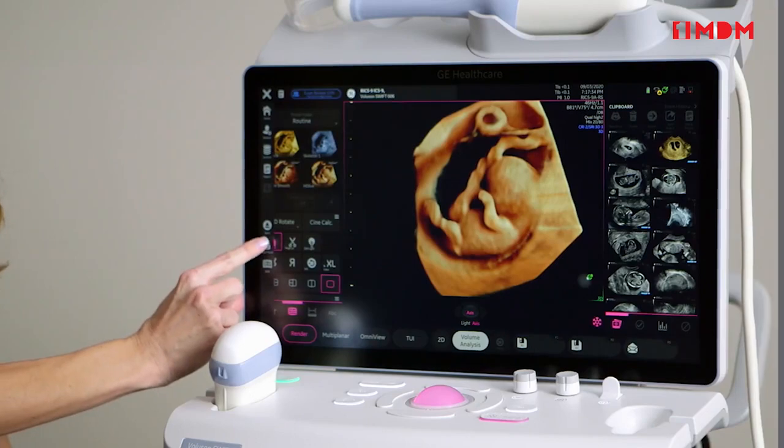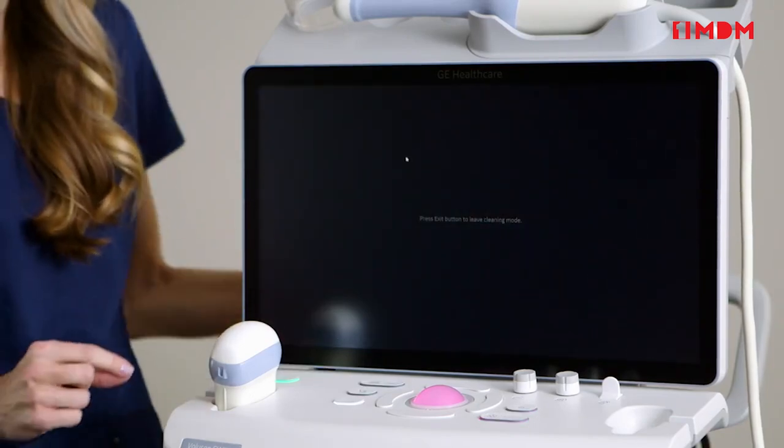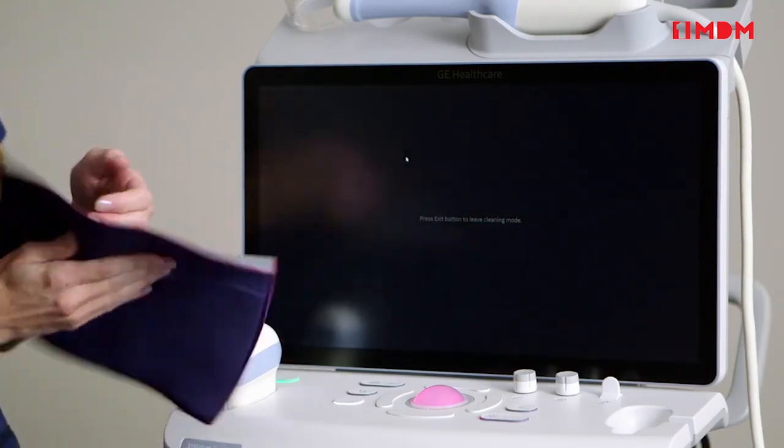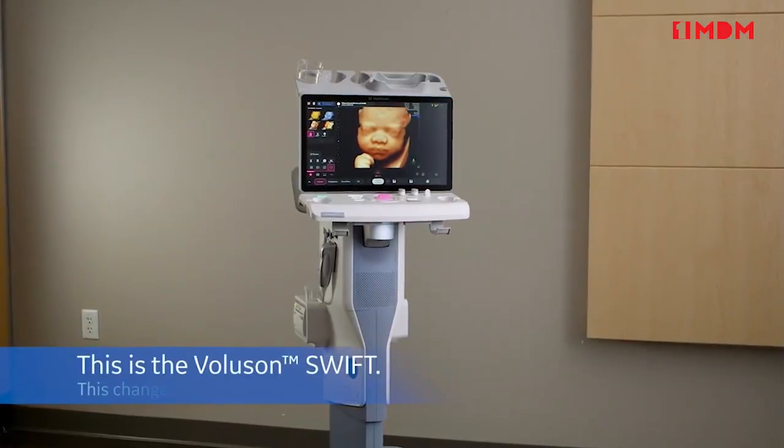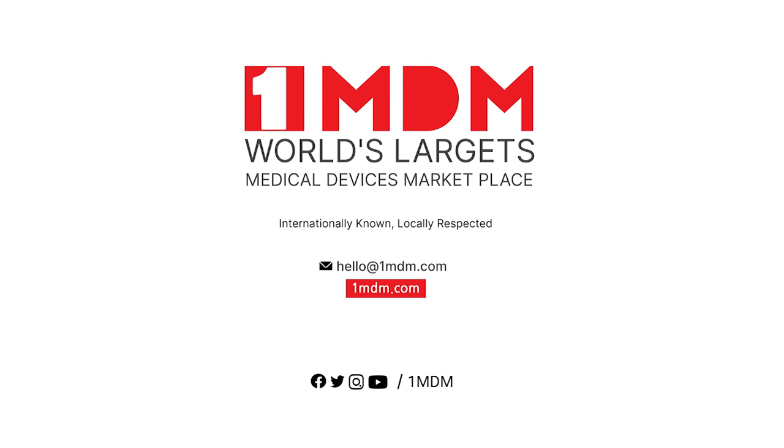Designed for efficiency, cleaning is fast and easy, enabling the user to lock the screen for disinfection of the system. This is the Voluson Swift, and this changes everything.